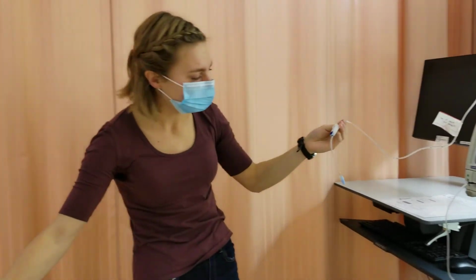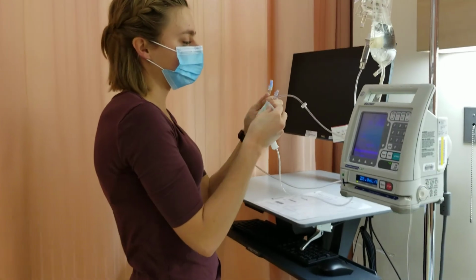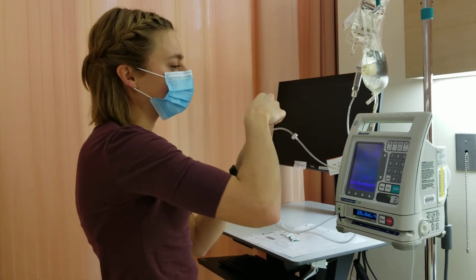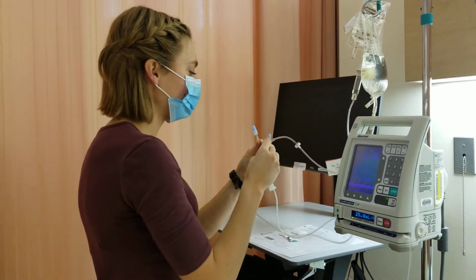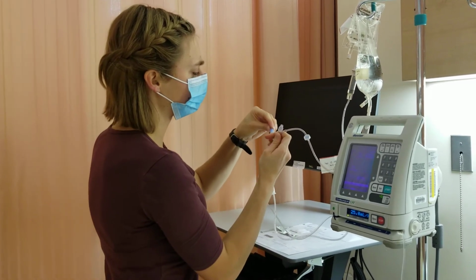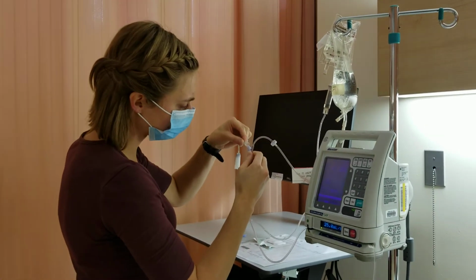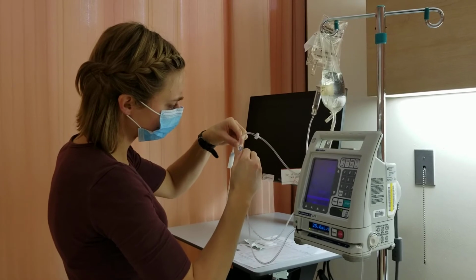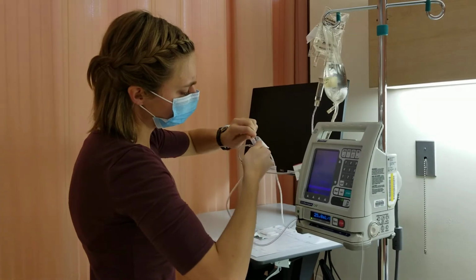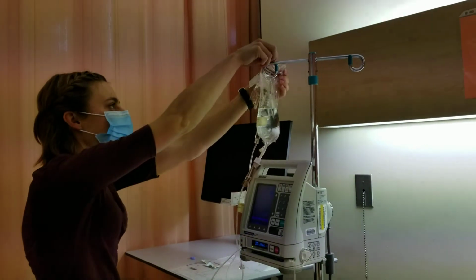I'm going to take an alcohol swab. We'll swab this cord for 30 seconds, let it dry for 15. Well, that's attached. Now I can back prime my medication.